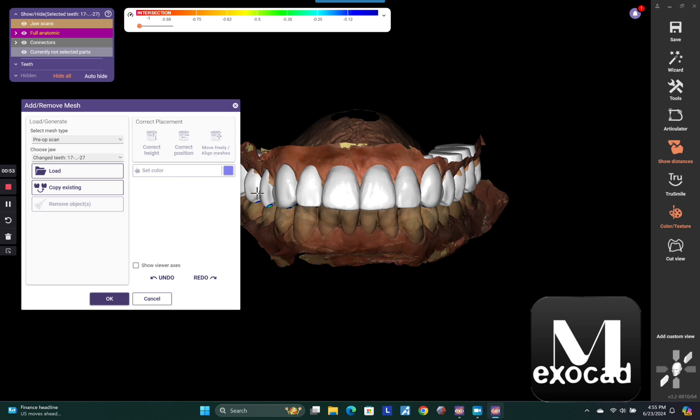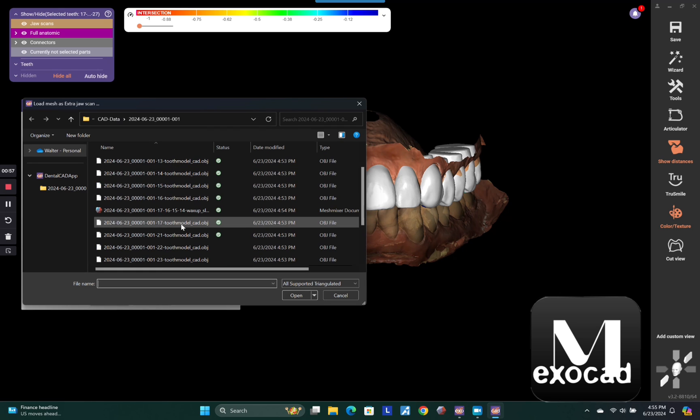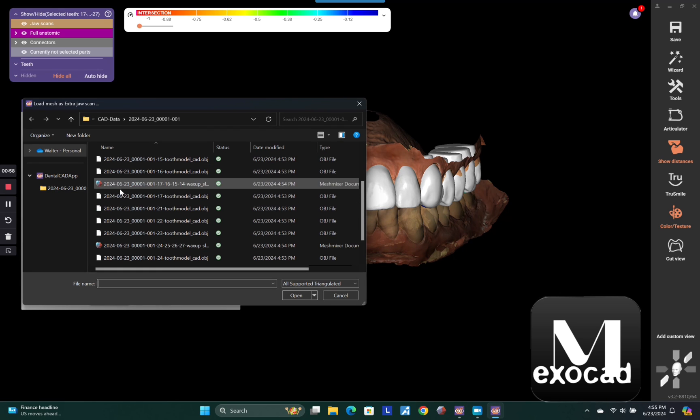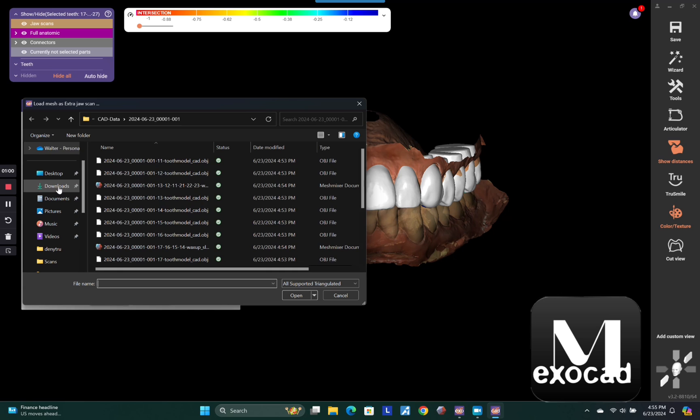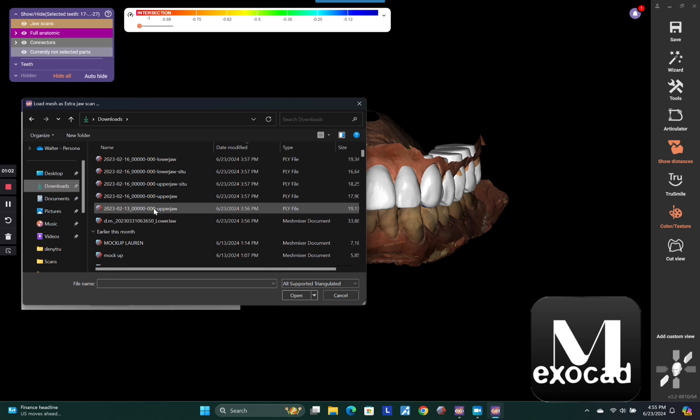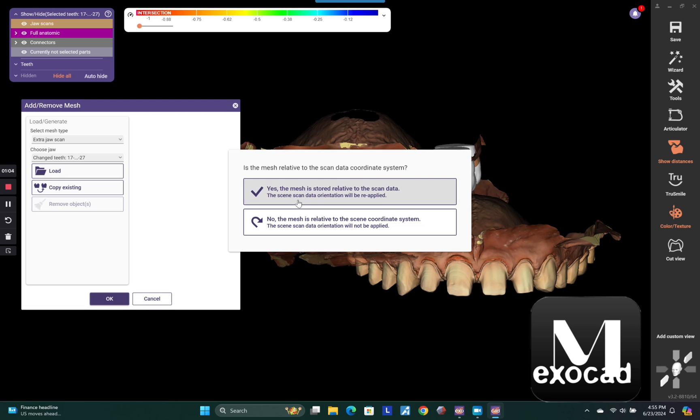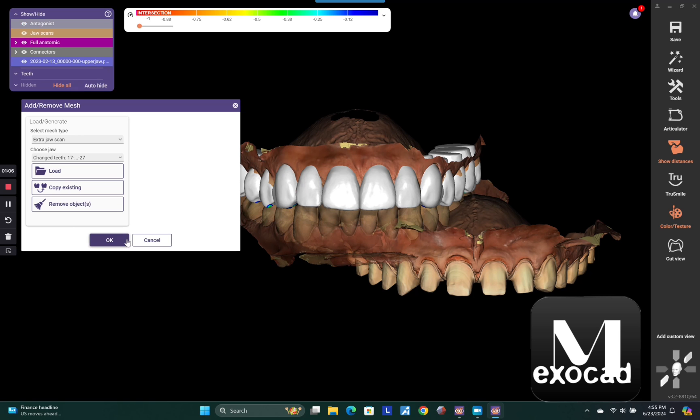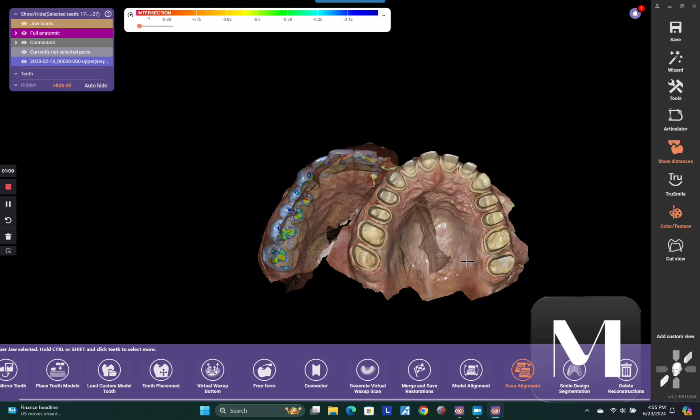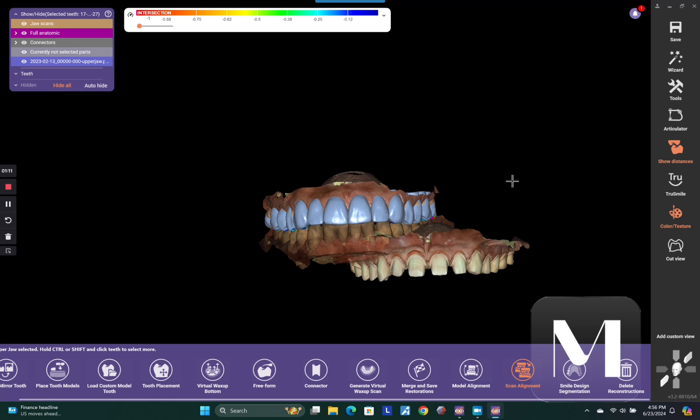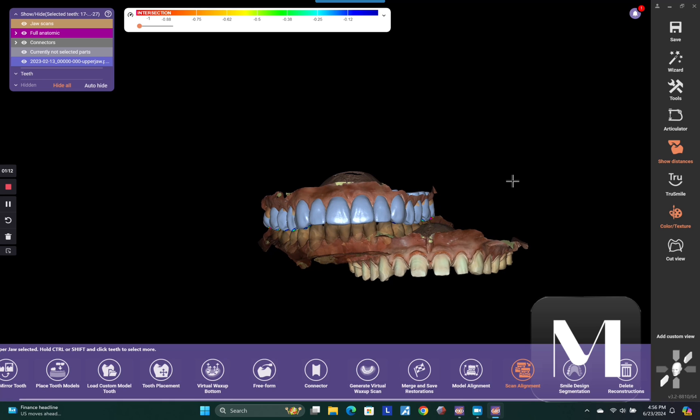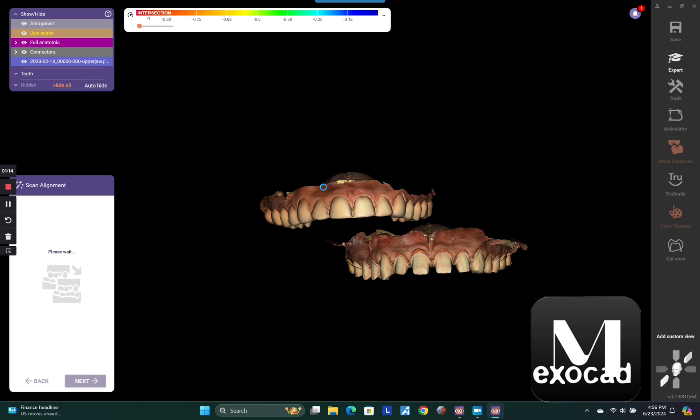Then go to tools, add remove mesh and go ahead and load the new prep scan. And this is the day of preparation now. So you're going to find that prep scan. This is real time for this part of the video. It's just wicked fast because I'm trying to keep it under five minutes here. So this is not sped up at all.